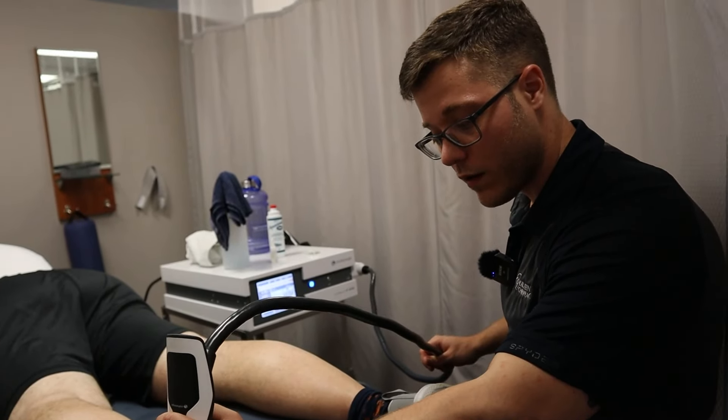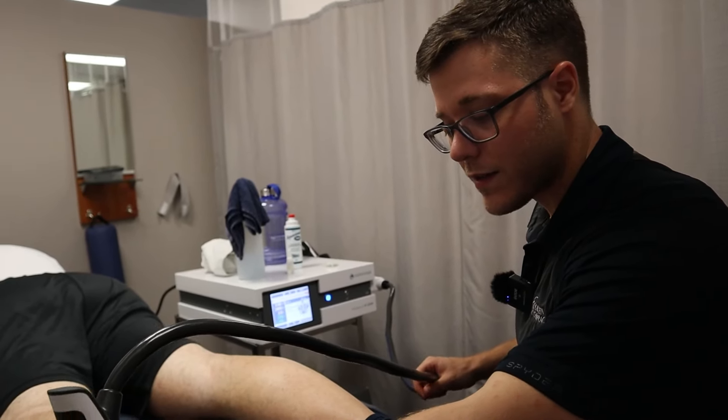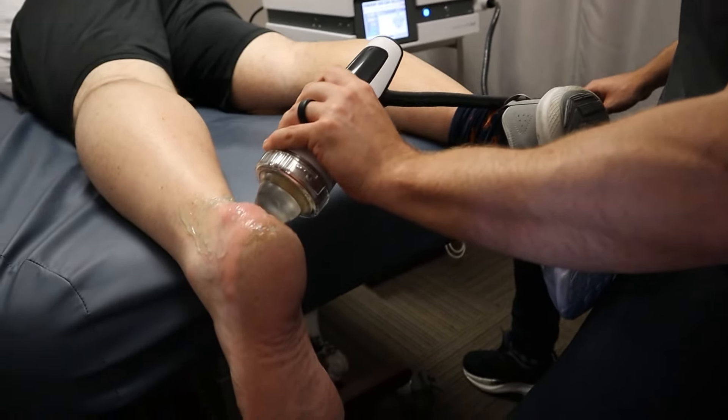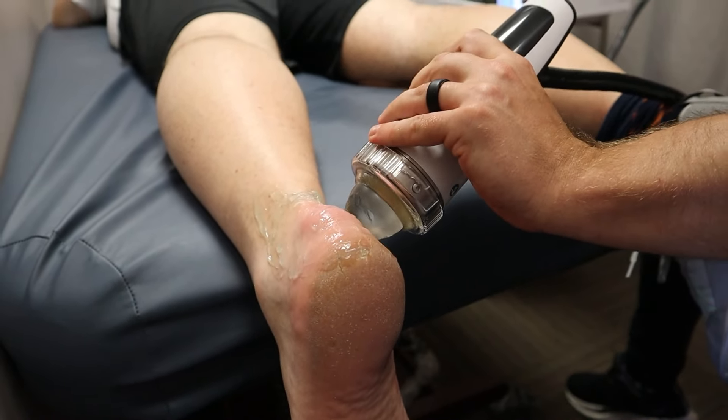You know, starting to sweat because it's really hitting them. You don't need it that high. It's not a no pain, no gain situation. We just need you to feel a little uncomfortable to make sure it's working.